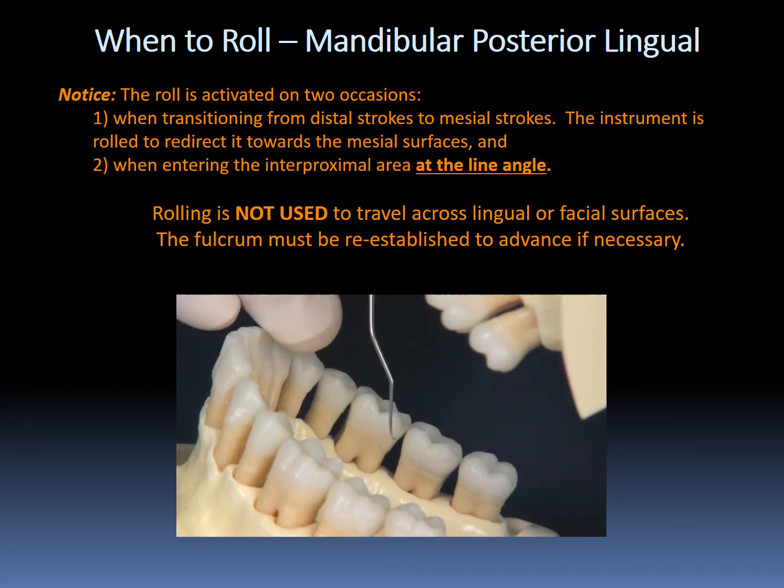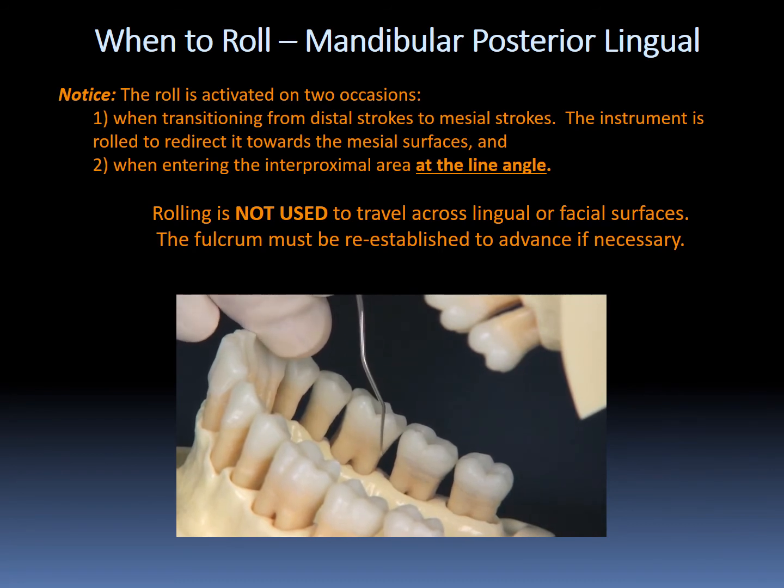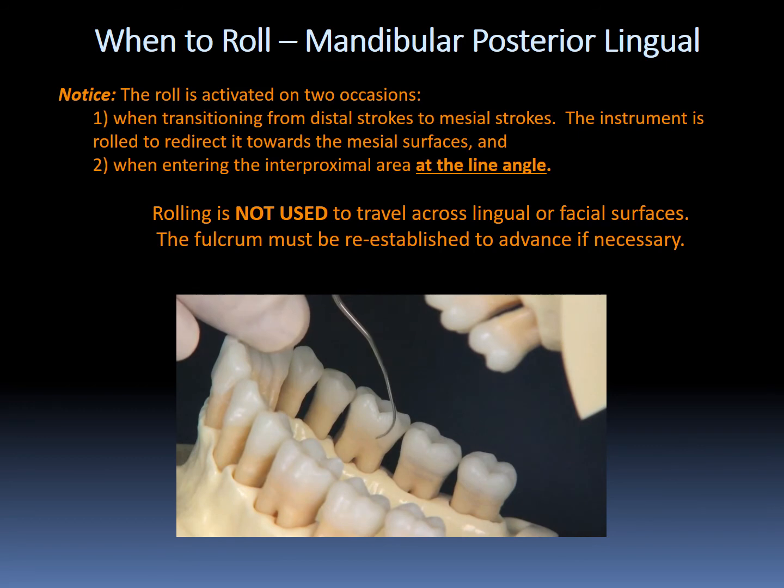Now we're going to come out and adapt again. You readjust your fulcrum a little bit, adapt to the distal, and then do vertical strokes on the distal surface. Come out. I just use my thumb now to roll around, and I move my fulcrum over here a little bit more toward the anteriors to position the tip. I'm feeling with the first few millimeters of the tip of this Explorer, and my thumb has to roll a lot right there to adapt to the mesial. And I rock back very slightly on the fulcrum.